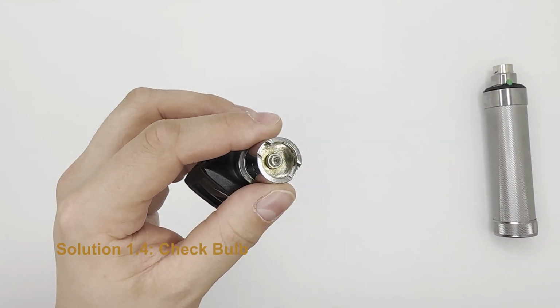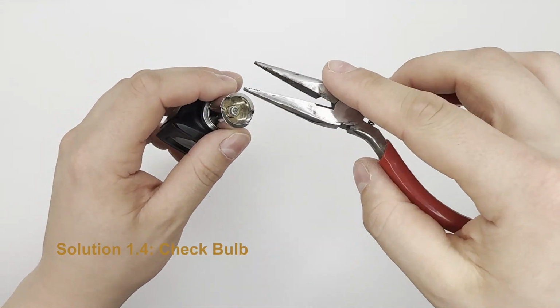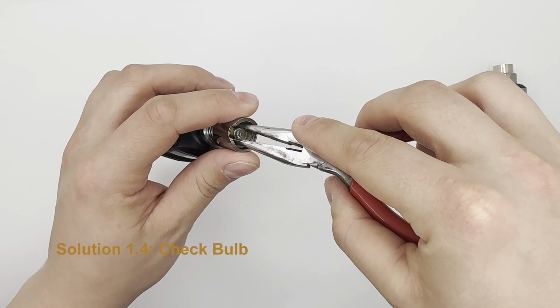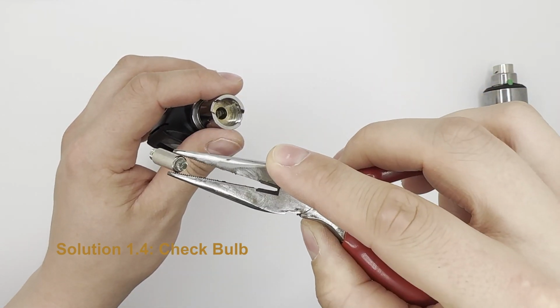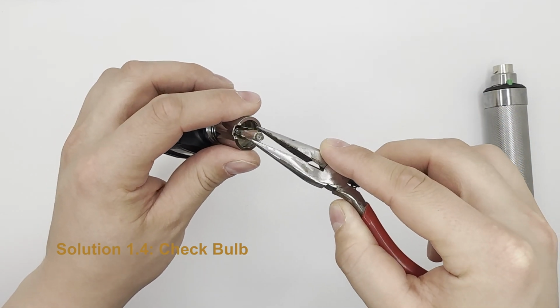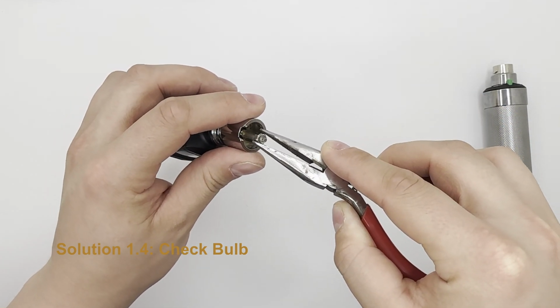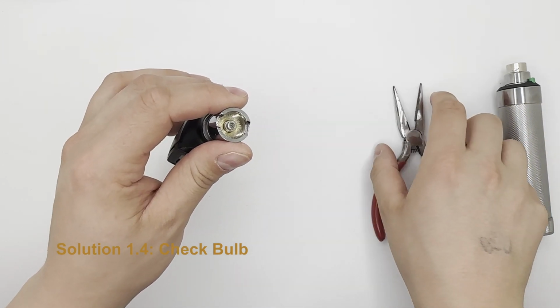The light bulb sits at the base of the head. Use your fingers to grip the bulb and gently pull it straight out. Check for signs of visible damage to the bulb. Use a multimeter to verify that there is continuity between the brass ring of the bulb and the chrome plating on the outside of the bulb. If the bulb is damaged or if there is a break in the circuit, a new bulb may be needed.